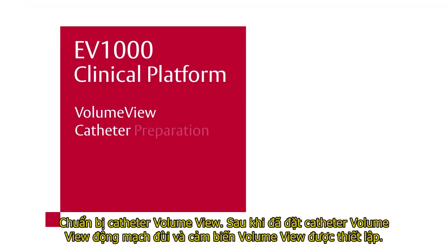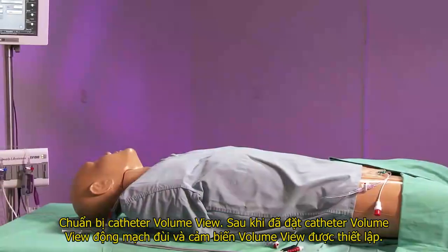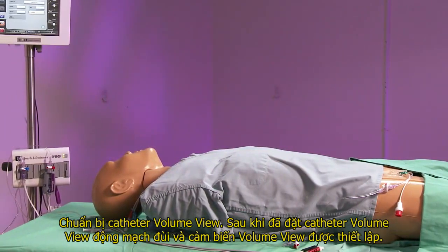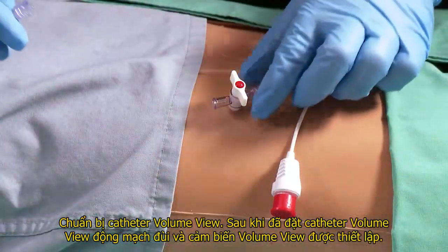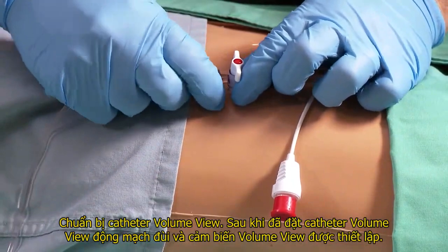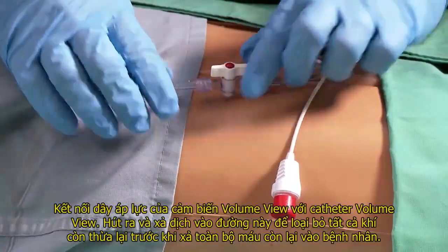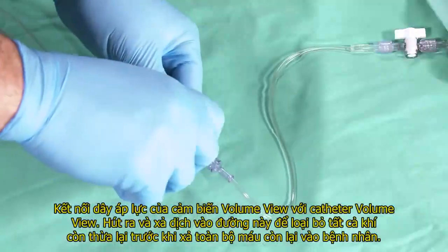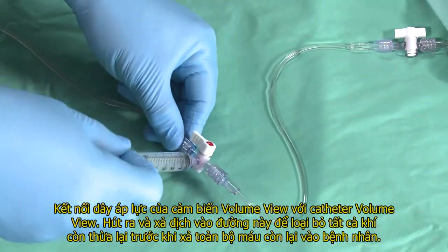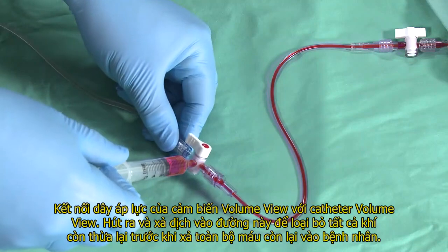VolumeView catheter preparation. After the VolumeView femoral arterial catheter is inserted and the VolumeView sensor is set up, connect the VolumeView sensor's pressure tubing to the VolumeView catheter. Aspirate and flush the line with a syringe, removing any residual air before flushing residual blood to the patient.